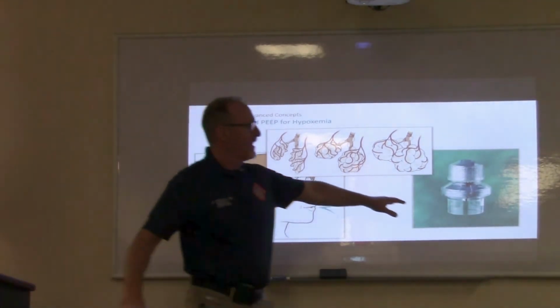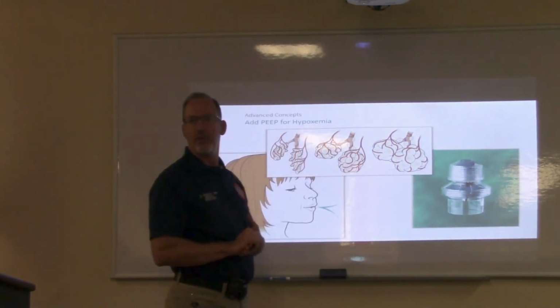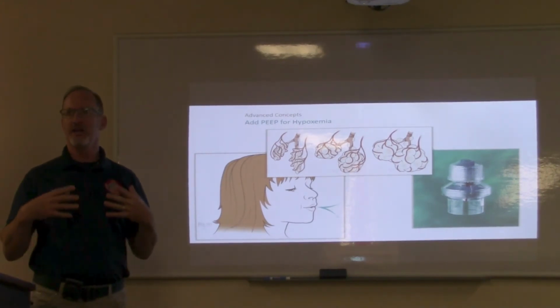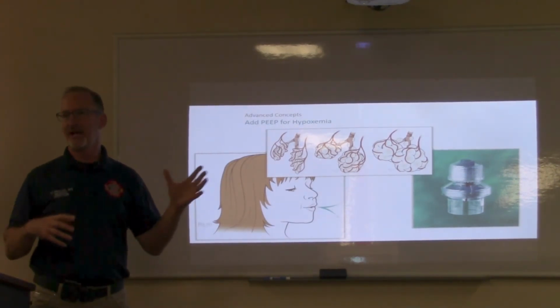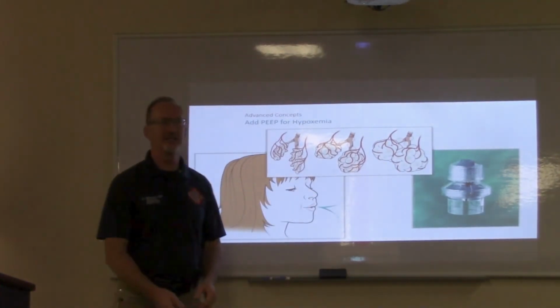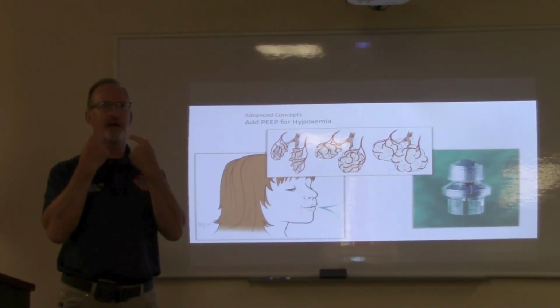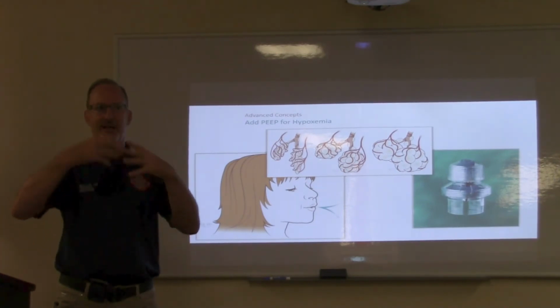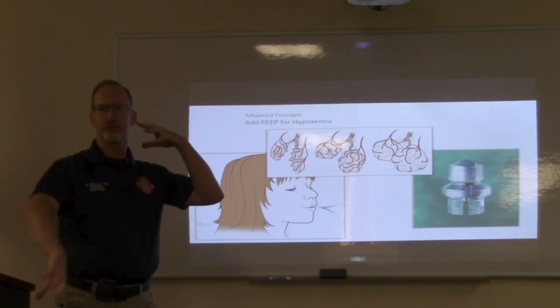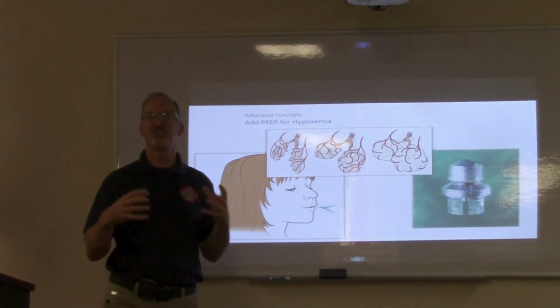So these valves, and there's different brands. Some are blue, some are red, some are much narrower, but they all do the same thing. They're generating pressure when you release the bag, and I'm going to show you a video of this in a second. What the PEEP is doing is the same thing that the classic COPD pursed lip breathing is doing. When somebody breathes out, they're creating their own back pressure when they exhale. That back pressure is transmitted all the way down into the smallest airways of the lung, into the alveoli, and helps keep them, we often say, stent them open.